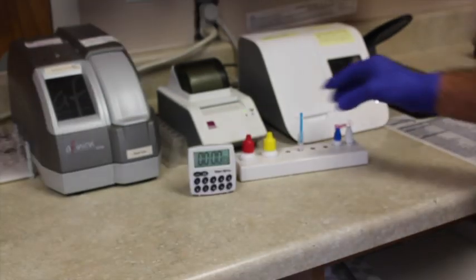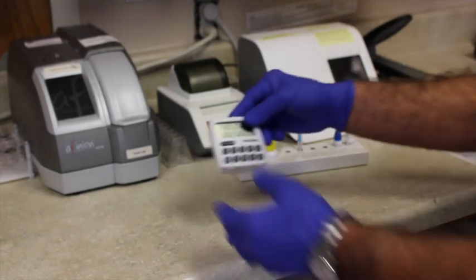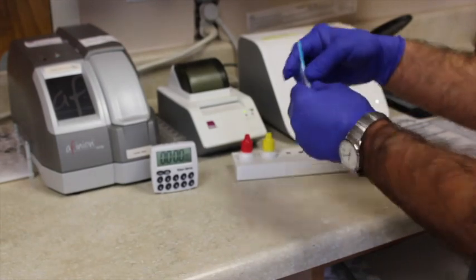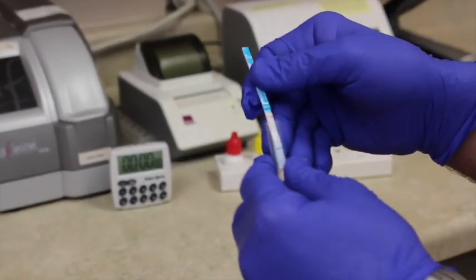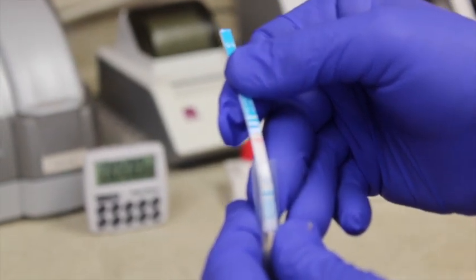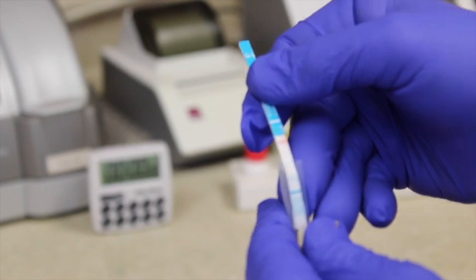After five minutes the alarm goes off and you read the result. You pull it out — if you have one line, that's a control line and that's a negative. Two lines will be positive. You can see that we have a negative result here.